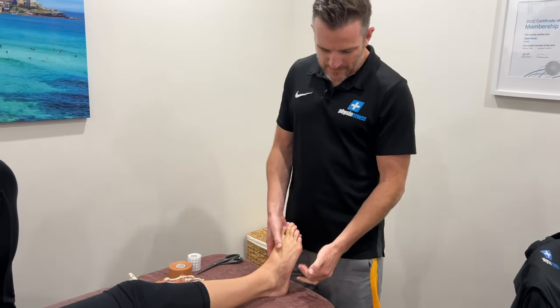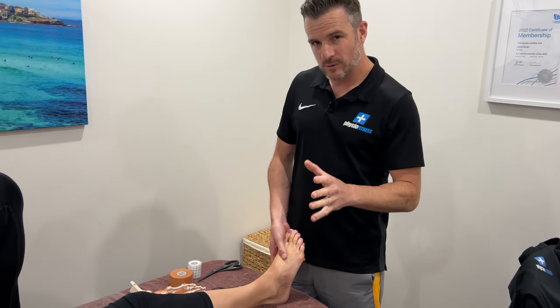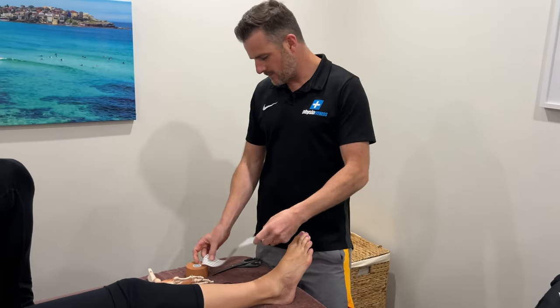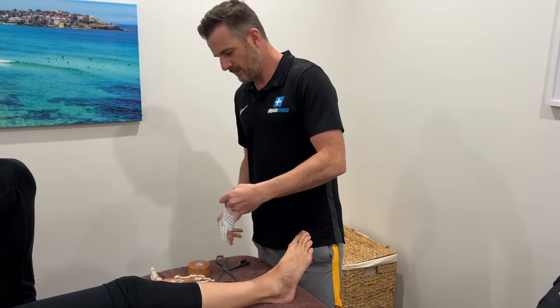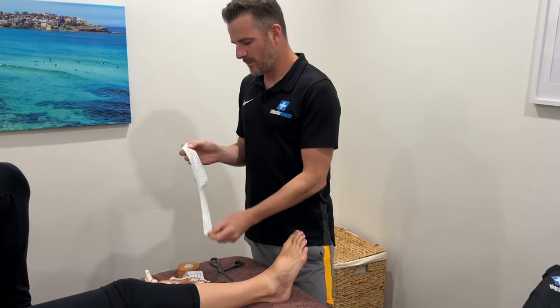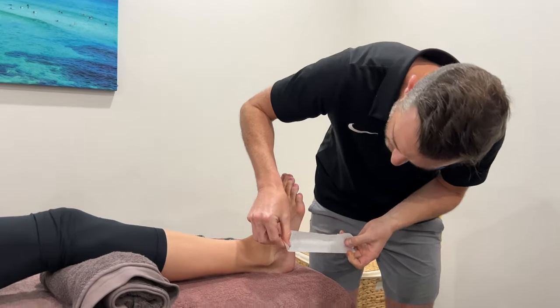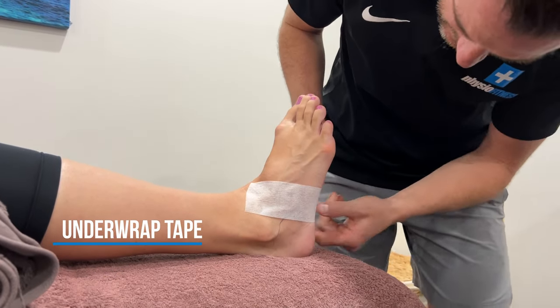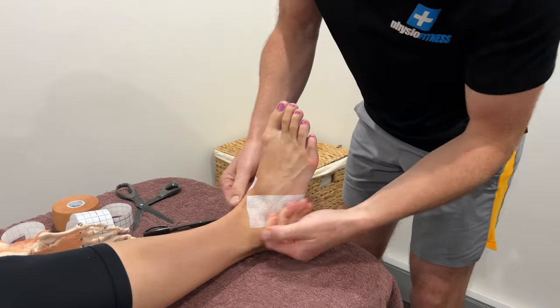The good thing about these little avulsion fractures is she doesn't have to be fully booted because she has minimal pain walking - only on certain movements - and you can just stabilize one segment. We're going to put a bit of underwrap under that because I want her wearing this for three or four days. If you just put tape on the skin for three or four days, it's going to get a little bit manky. So a nice little barrier like this is going to help her. We're going to put it under her foot, under her arch. We only need one strip of that because that's exactly where we're taping.